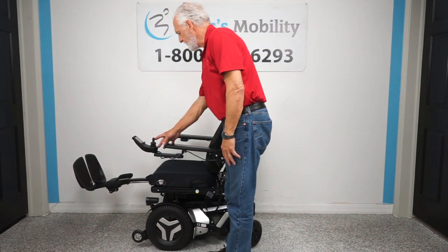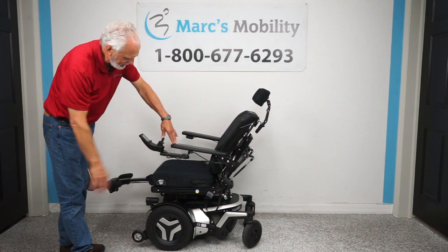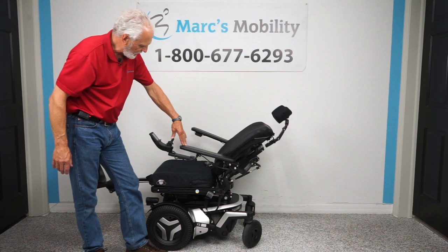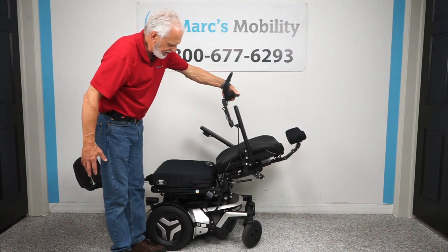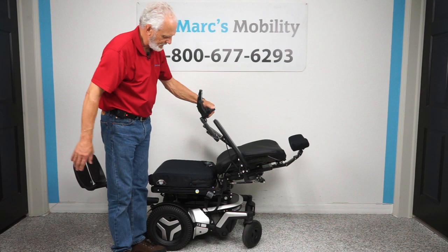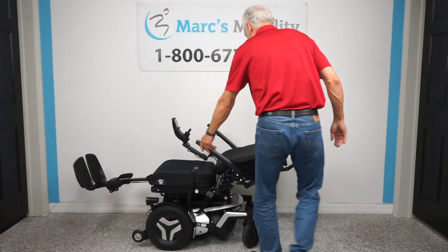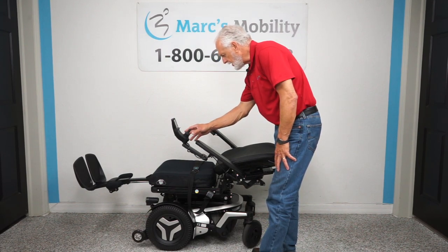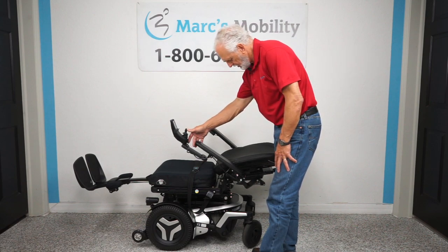The only function left is the back. The back is just the back going back — nothing else on the chair is moving. This is called a recline motion. Let's see how far it goes. Remember, the arms flip up, so if you transfer from the side with a slideboard you can flip the arms up with no problem. There's a safety belt here. We'll now bring the recline back up.